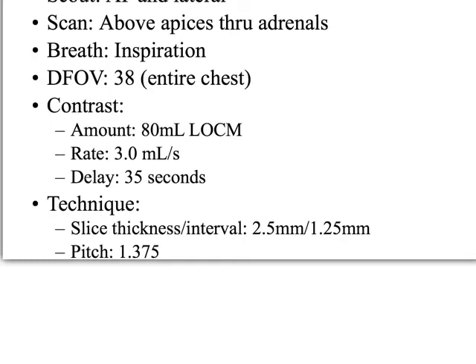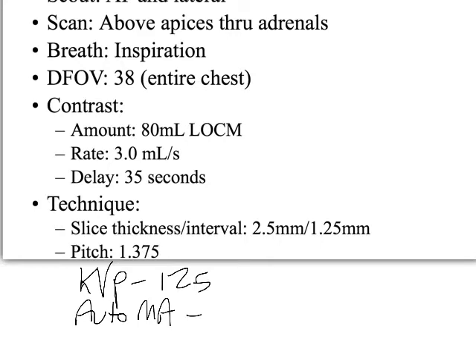That's going to be consistent throughout all of these protocols that we're looking at. KVP wise, we want something around 125, and then we can generally use auto mA on these, and we'll give it a max and a minimum. So the minimum might be around 100 through a max of maybe 150 for the new generation scanners.